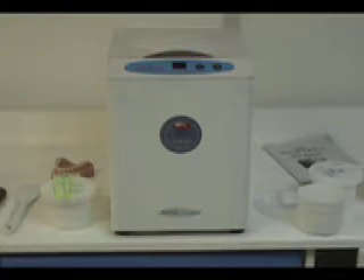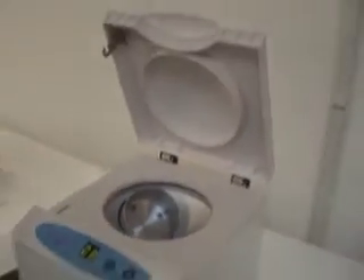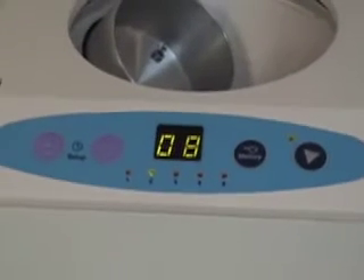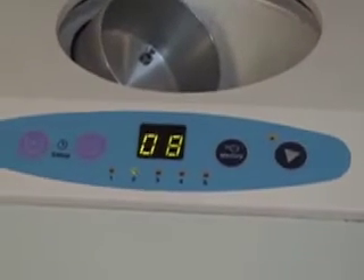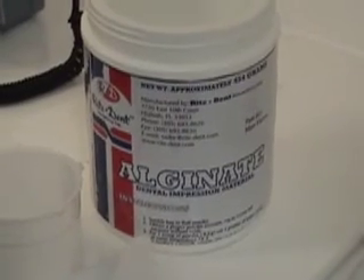The AM100 Alginate Mixer by Rydent is a revolutionary new way to mix perfect alginate. This state-of-the-art centrifuge is a tabletop, lightweight machine. With an easy-to-read display and one-step operation, running the AM100 is a breeze.